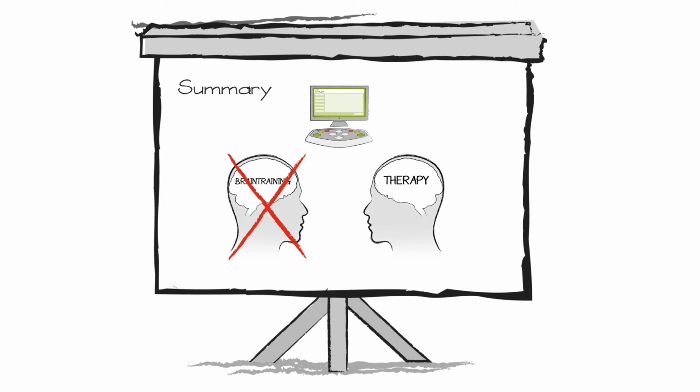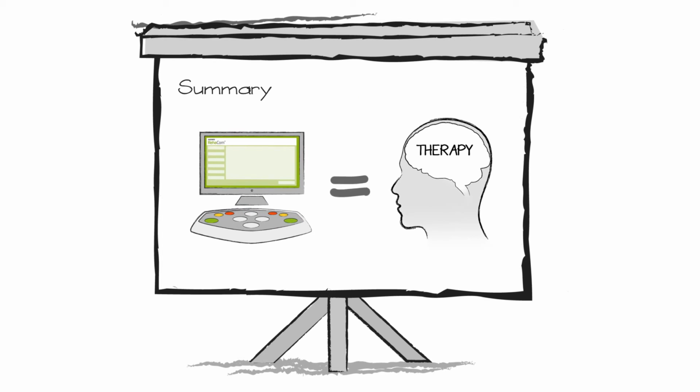RehaCom is much more than brain training. RehaCom is therapy.